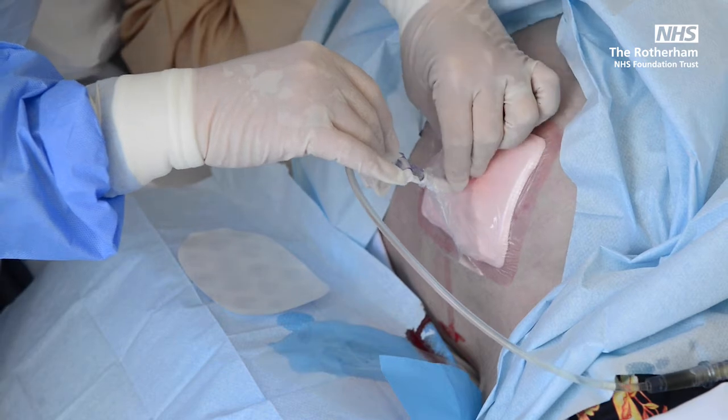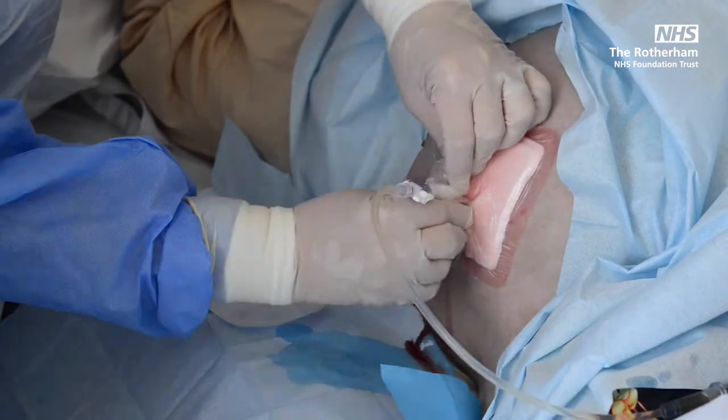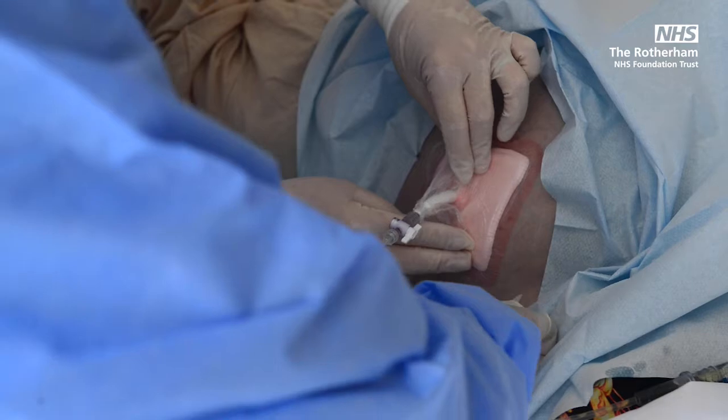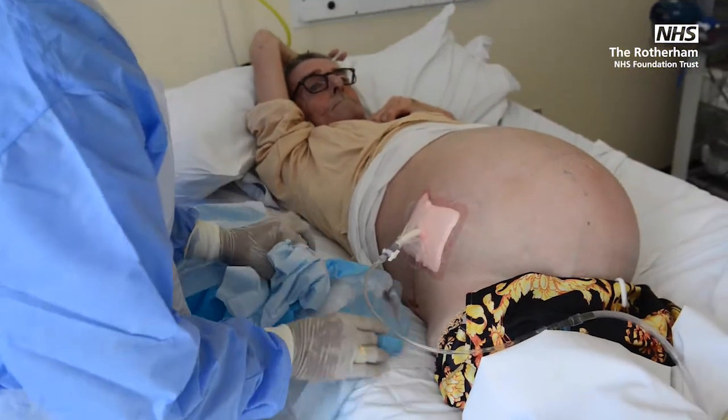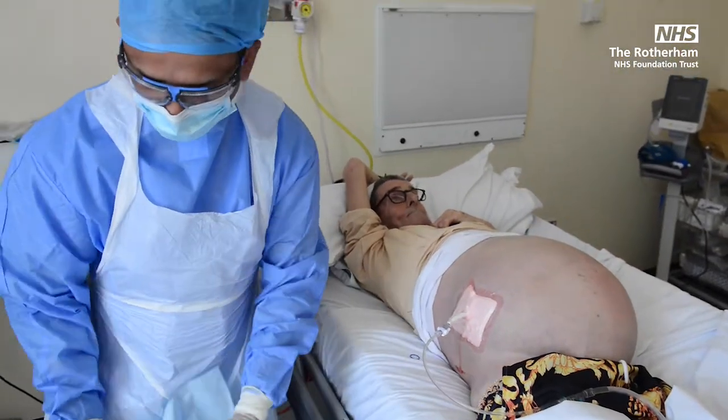So the drain is fixed now. And I'll remove all the dressings now for him. So the procedure is complete.